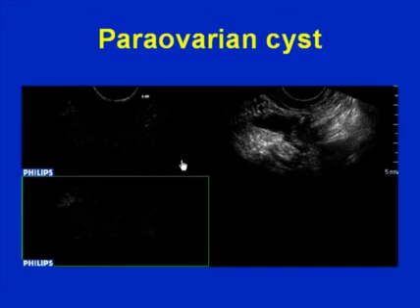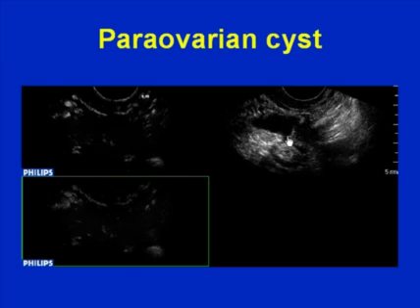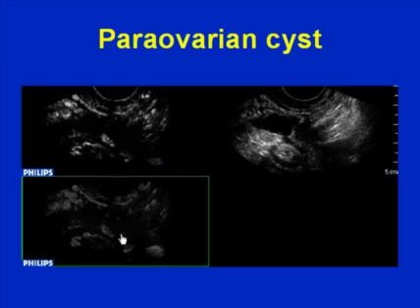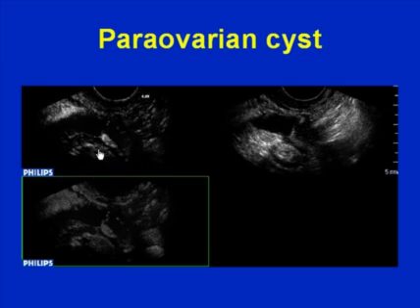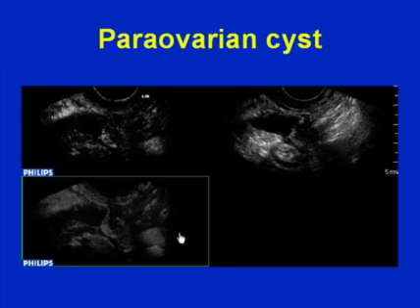Now here we have an image of a cystic mass. This is the fundamental image, the 2 by 3 centimeter lesion. Here's the contrasted image. This is the microvascular or maximum intensity projection image. And as you can see, with the contrast flowing in, we saw no abnormal areas in the wall of the lesion, and we could determine that this was most likely a benign lesion.